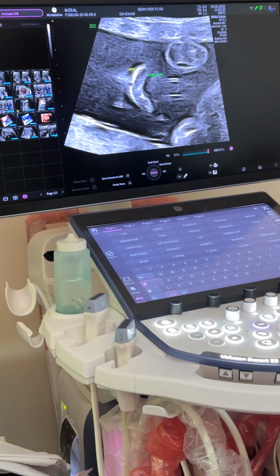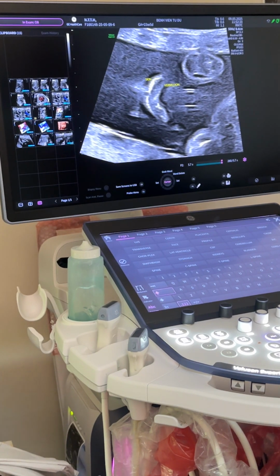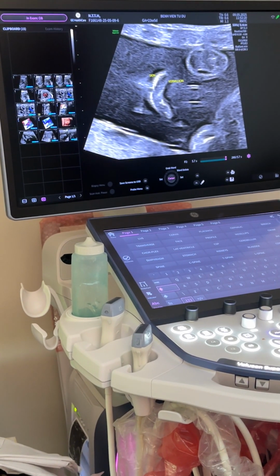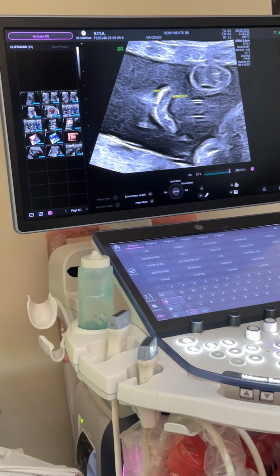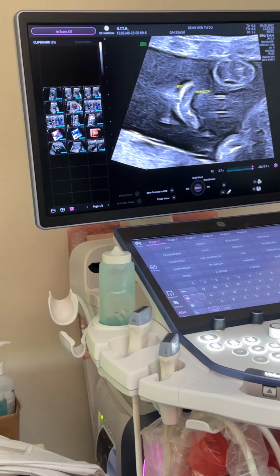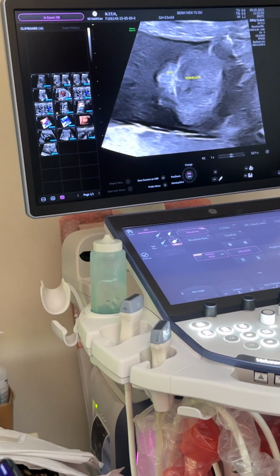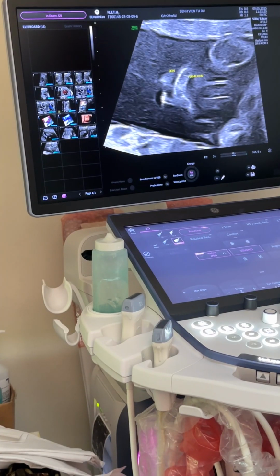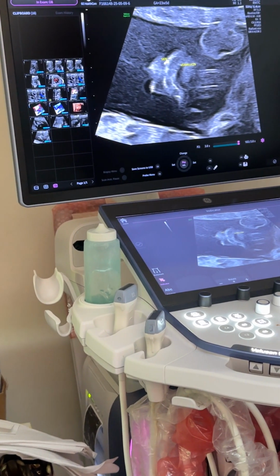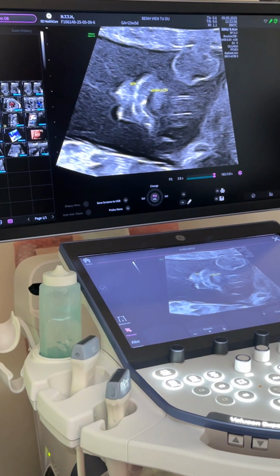So when you look with ultrasound, you can see the border between the vermilion and the skin, the vermilion cutaneous border. We miss most clefts that involve a breach in the cutaneous vermilion border where there is not a full thickness defect in the lip, because we don't look closely enough. So when you are looking at the lip, look at the cutaneous vermilion border and ask yourself, is there a defect in the border? Because you may pick up very subtle clefts that are not full thickness.